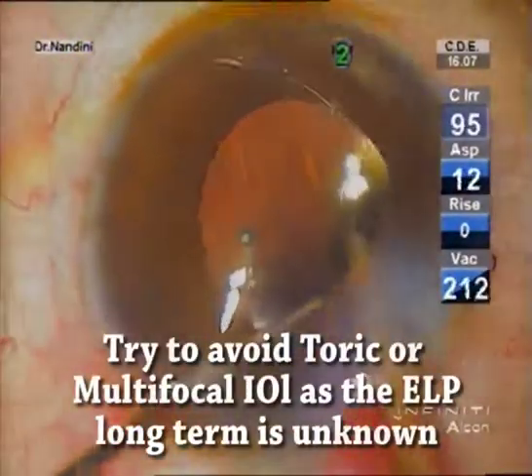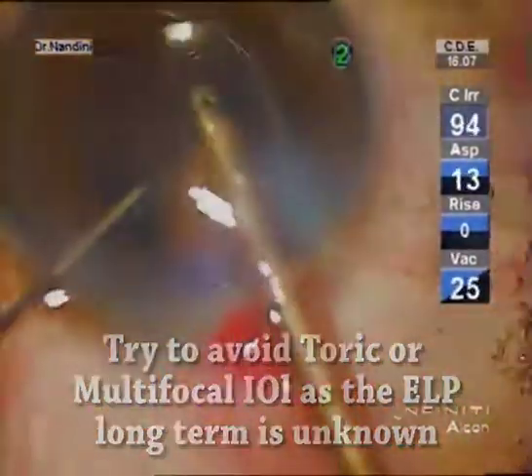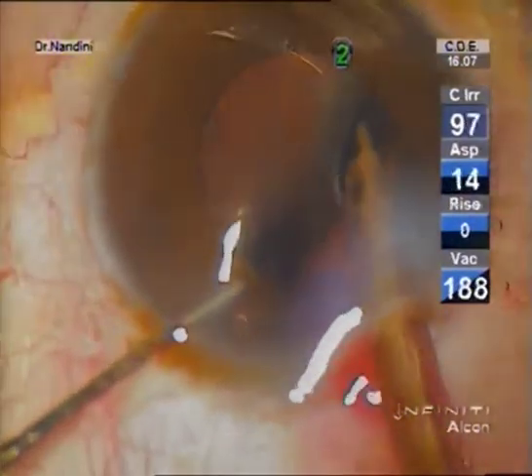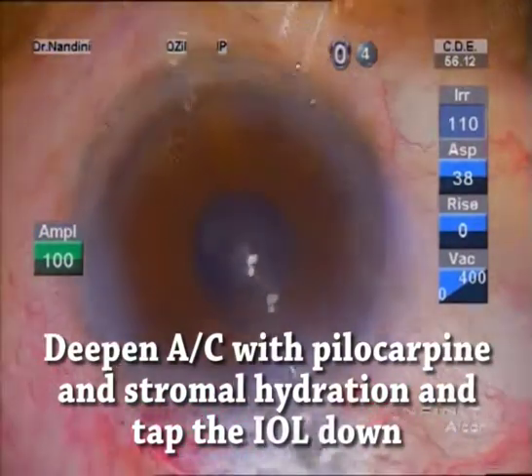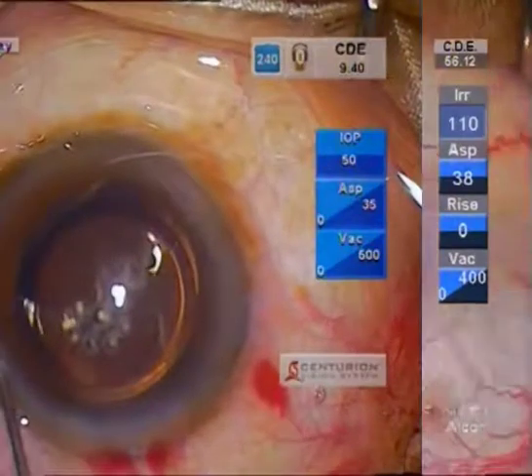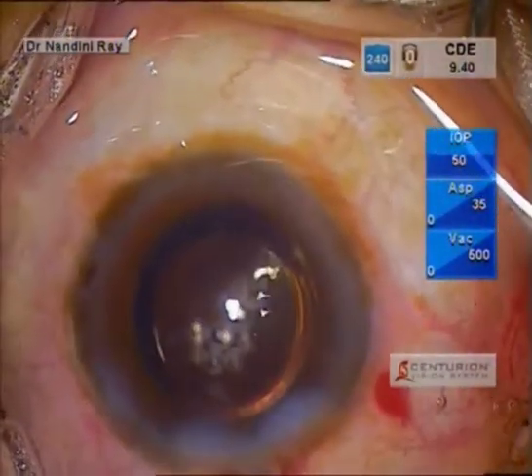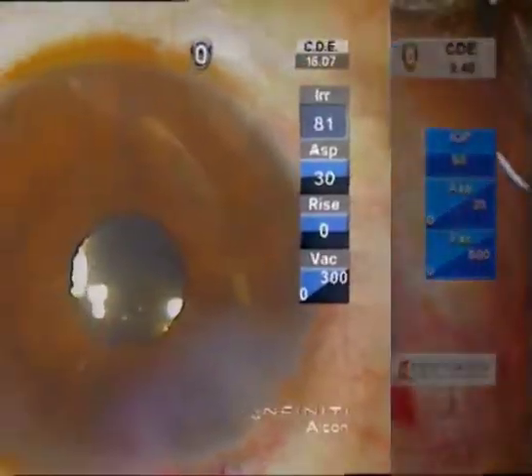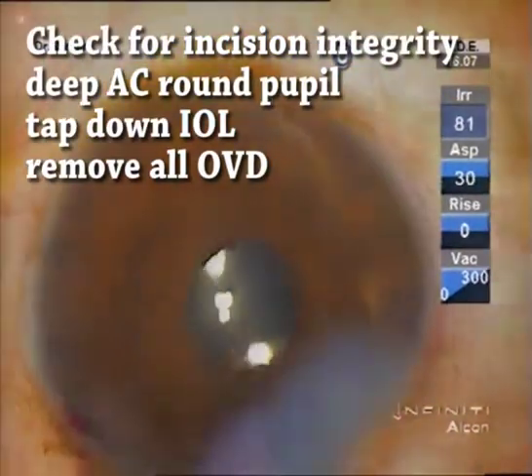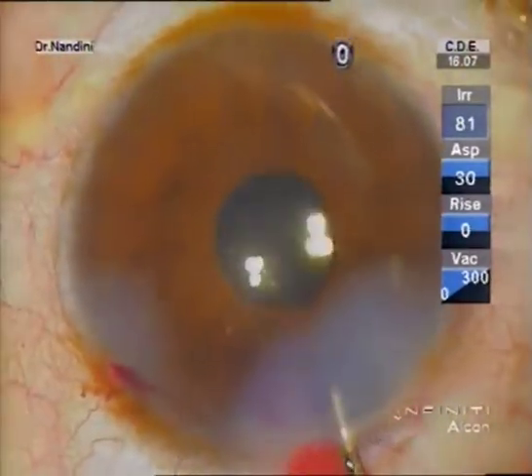One should try and avoid a toric or a multifocal lens in these cases, as the long-term effective lens position is always questionable. Deepen the anterior chamber with pilocar, make sure that the pupil has come down and the anterior chamber should be deep. The wound integrity and the closure of the wound is very important. The intraocular lens is tapped down after removal of the OVD. This will ensure a deep anterior chamber, a stable intraocular lens, and a happy patient post-operatively.